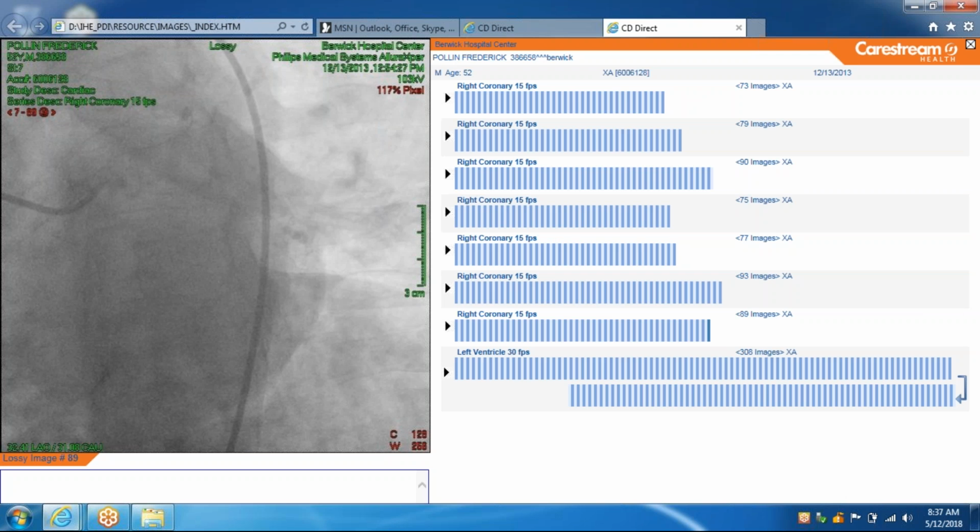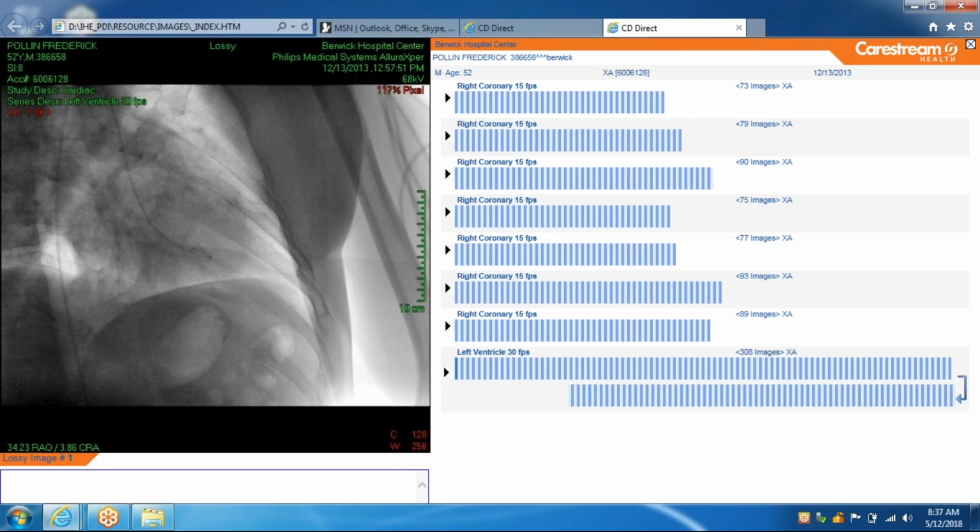And then the left ventriculography, where the pigtail catheter is positioned into the left ventricle. Okay, so you can see the pigtail catheter right there. It's a curved catheter because if it was a straight catheter and you're going to power inject, so we have a specialized injector that injects the dye under tremendous force, the catheter could just spear the left ventricle and traumatize it. So you use a curved catheter instead.